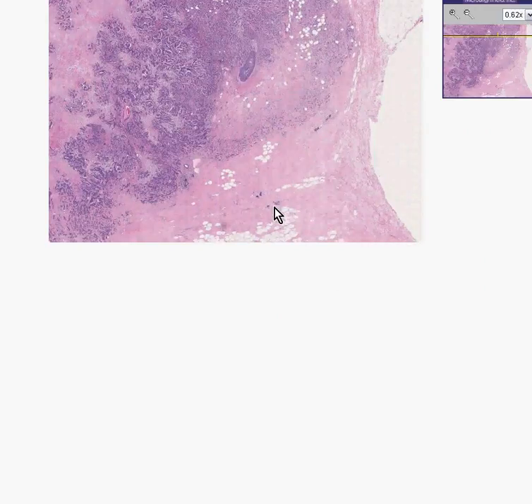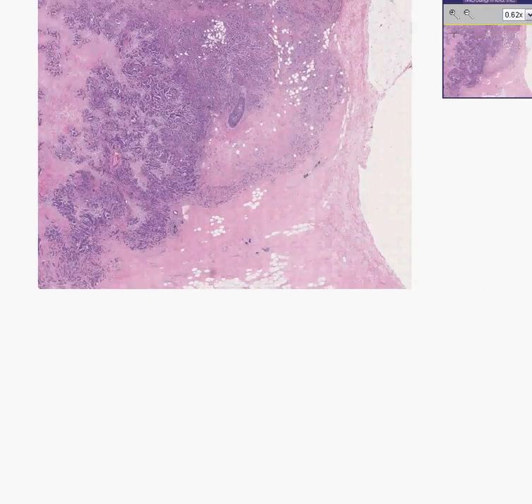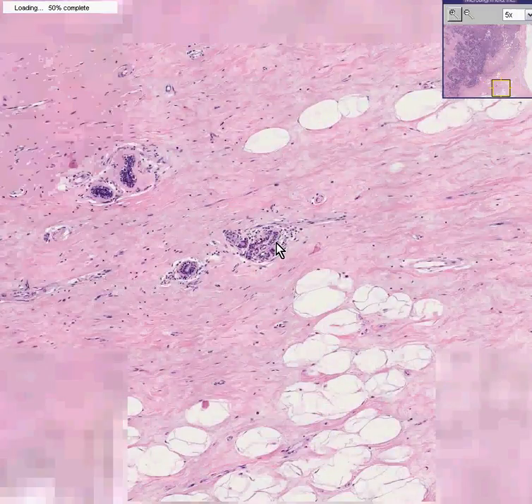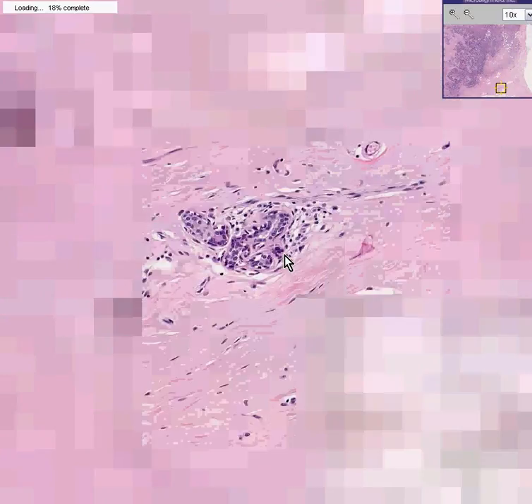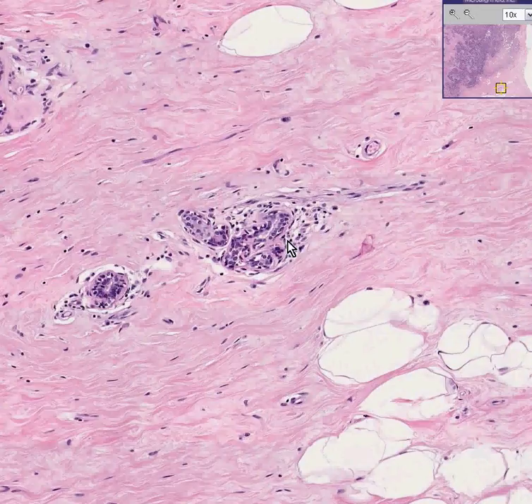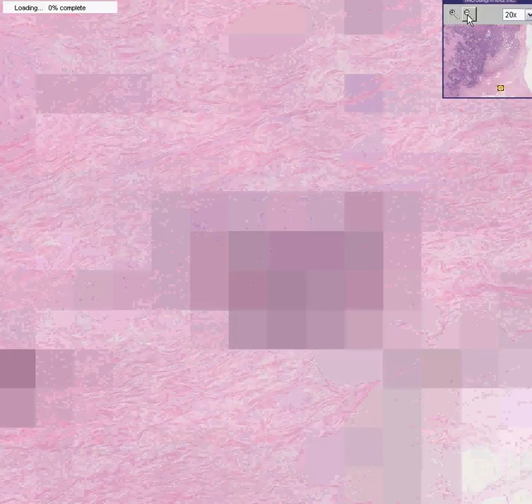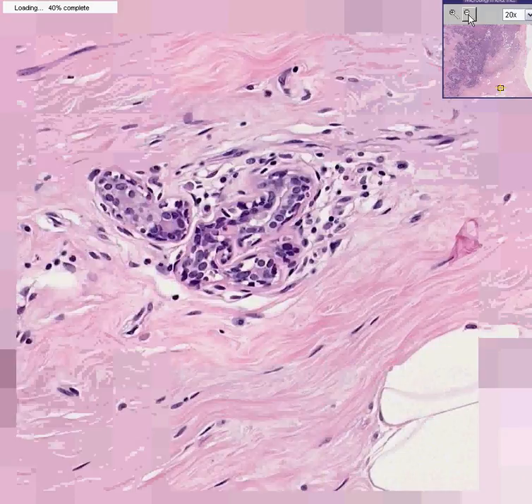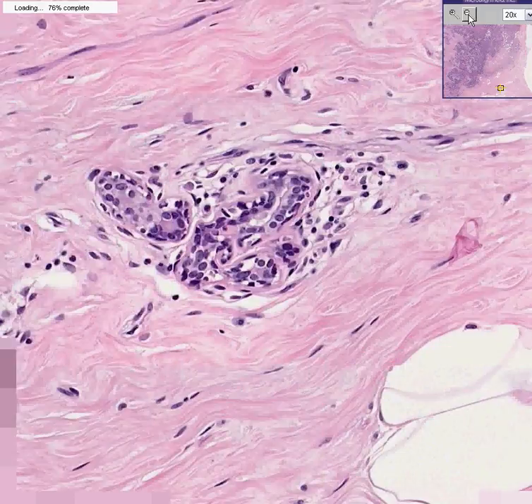If you look at this part of the breast for comparison, I think I could convince you this is probably a normal lobule, even though it's small, part of a normal lobule. You could see some acini. You could see how there's some looser connective tissue around it. And then it's surrounded by denser connective tissue and ultimately intermixed in with a lot of fat. And there's your classic textbook normal lobule at the highest power we're allowed to go.